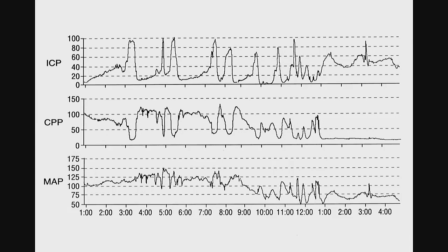These ICP surges in this TBI patient are going up to 90 or 100. And you know they're plateau waves because you have this mirror-type reduction in CPP. That's pathognomonic of what a plateau wave is. This is actually the brain vasodilating because it senses it's not getting enough perfusion. And there's not enough room in the skull, so the vasodilation itself drives up the intracranial pressure, that worsens cerebral perfusion pressure, that makes the vasodilation worse until the brain is stuck on the plateau in a vasodilated state.